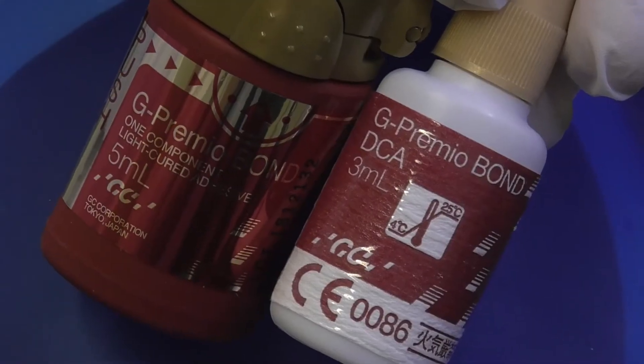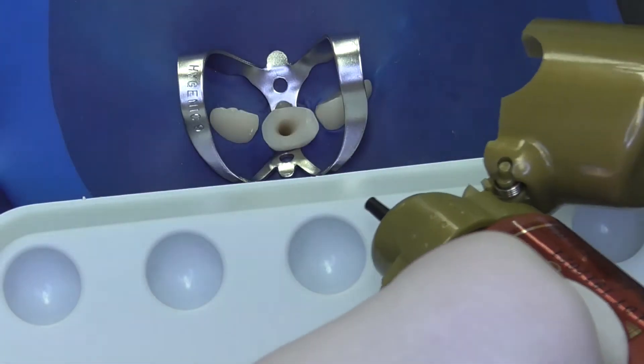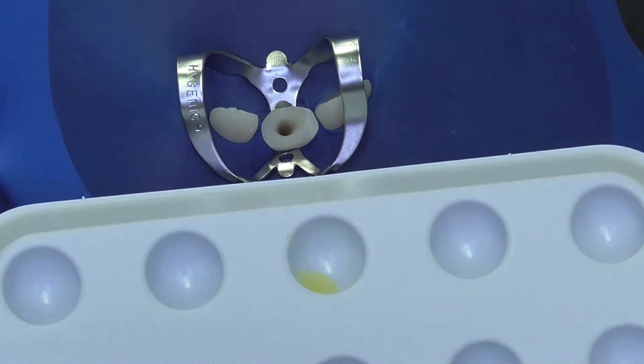In this case, we are using G-Premium Bond, which we will activate with a dual curing activator. A drop of activator will be properly mixed with adhesive, and thereafter the adhesive will be applied on the dentin surface to the root canal and to the marginal parts of the dentin.